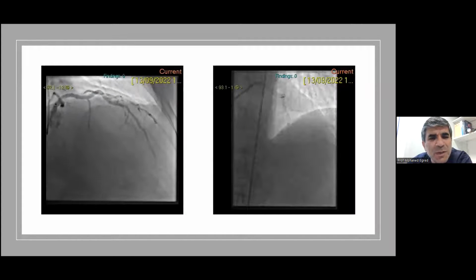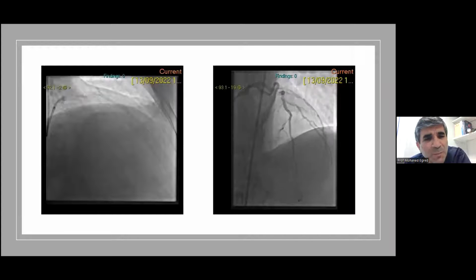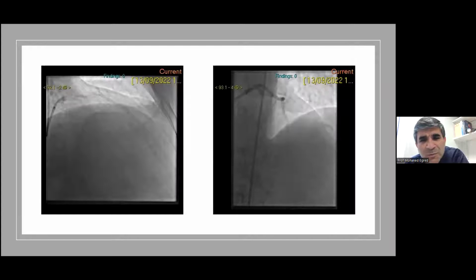And post dilatation, and this is what we were left with. I think having achieved open the artery, it's a huge artery, 4.0, approximately 3.5 in mid-vessel with dilatation, and this is how this was left.